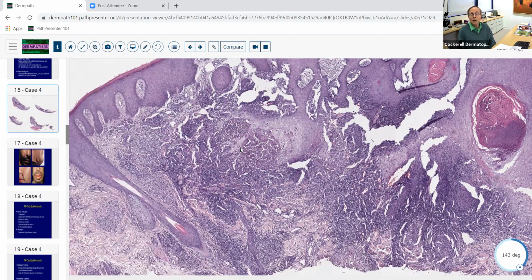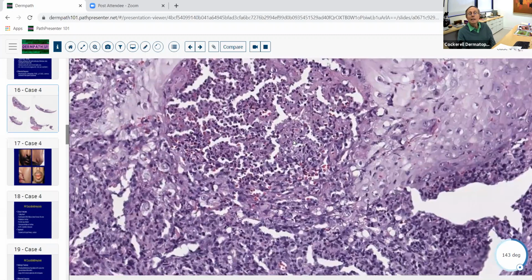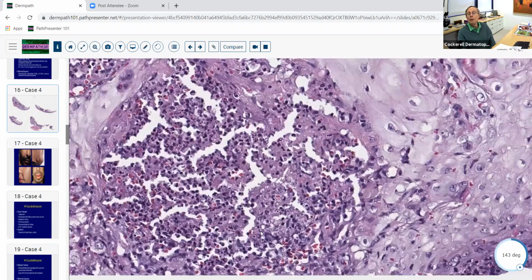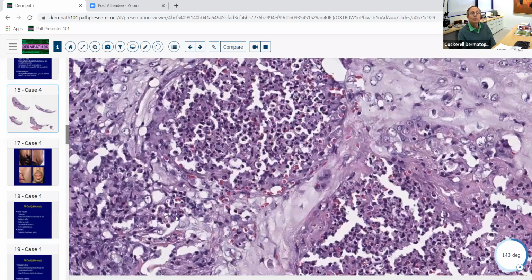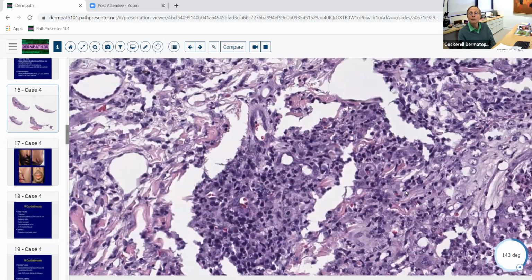Tuberculosis verrucosa cutis or something like that, maybe could give you a pattern like this. But basically we're looking at something that could be an infection. Whenever you see something like this, then you need to go on a bug hunt and start looking for the presence of organisms. And in this lesion here, I don't know if we're going to be able to see any organisms readily in this field here, but this was an example in this case.